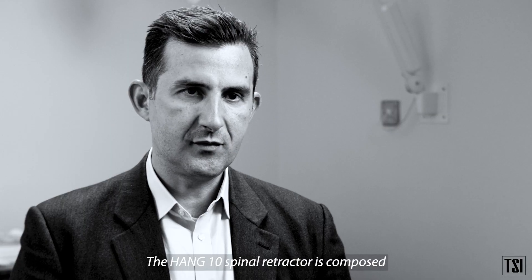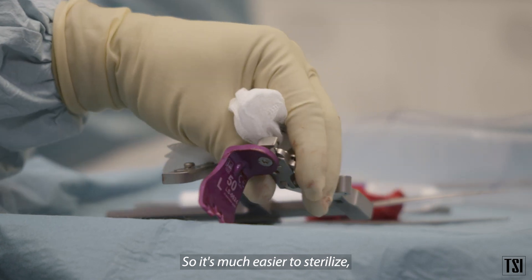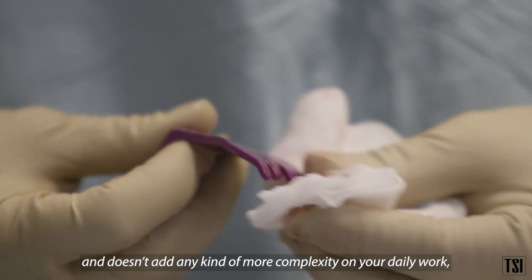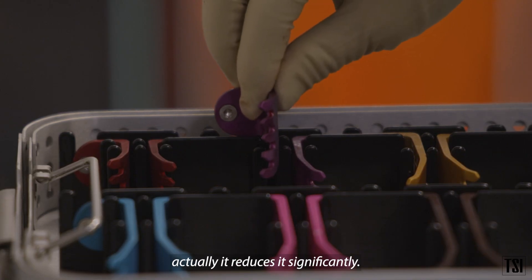The HANG 10 spinal retractor is composed of a minimal number of components needed during surgery, so it's much easier to sterilize and use during the surgical procedure. It doesn't add any complexity to your daily work — it actually reduces it significantly.